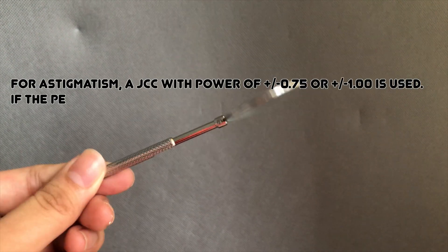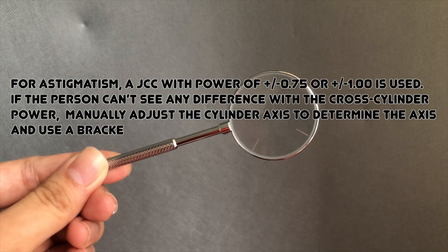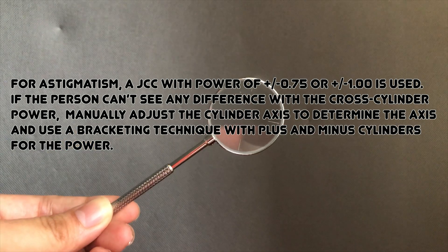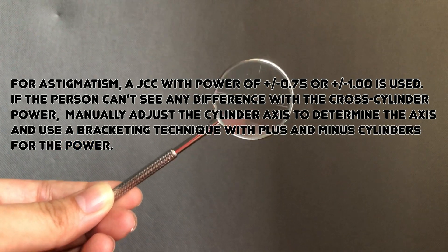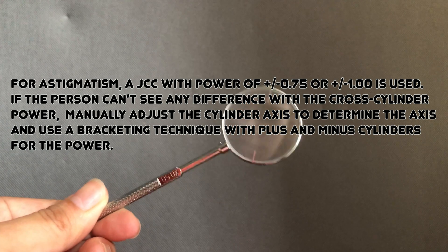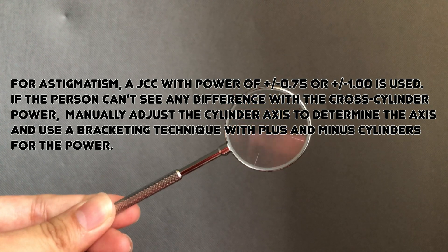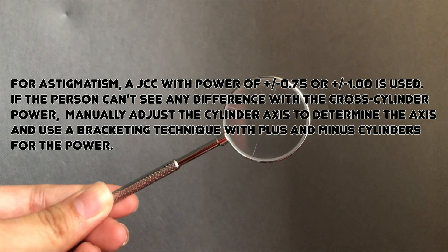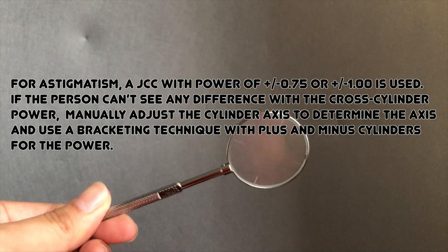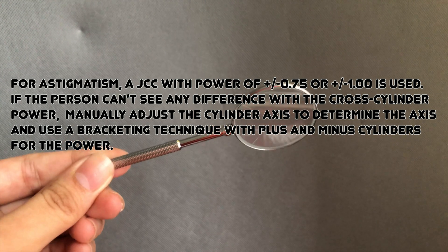For astigmatism, a JCC with power of plus and minus 0.75 or plus and minus 1 is used. If the person can't see any difference with the cross cylinder power, manually adjust the cylinder axis to determine the axis, and use a bracketing technique with plus and minus cylinders for the power.